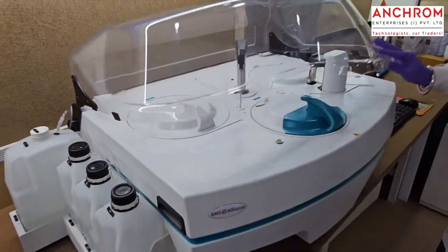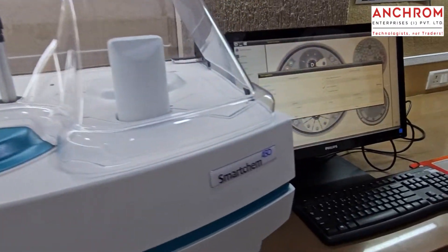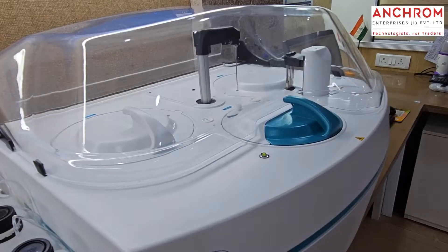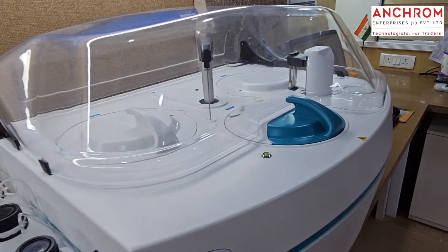Finally, click start on our easy-to-use software. We supply all the methods that you are going to need along with the instrument. Based on the method that you are running, the robotic arm will pipette out the correct volume of samples as well as the reagents into the correct cuvette.